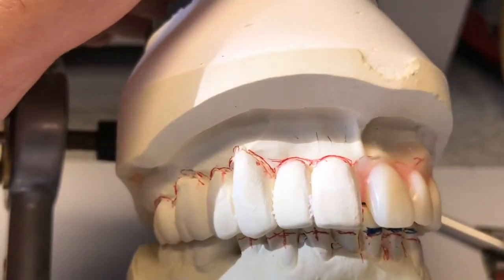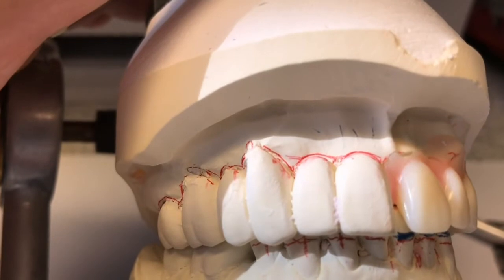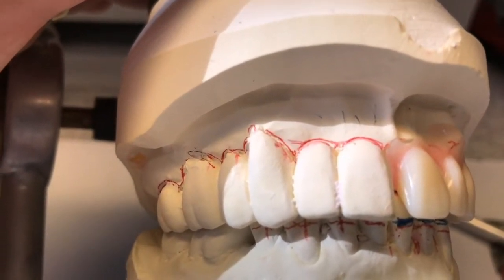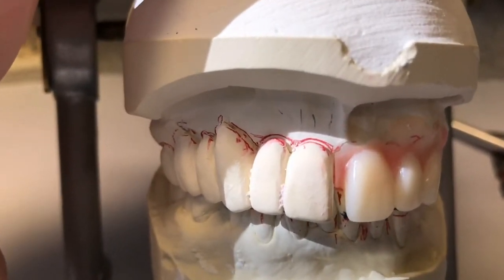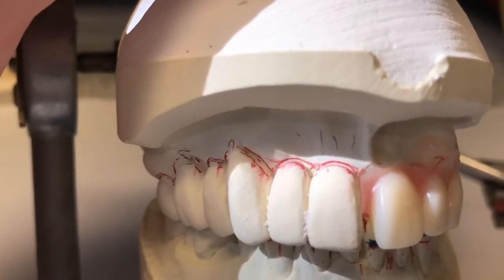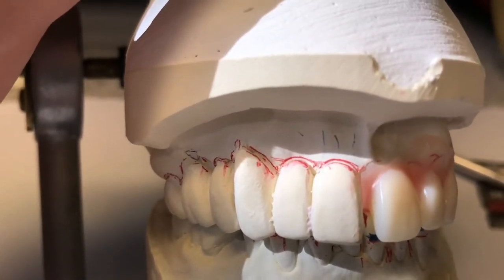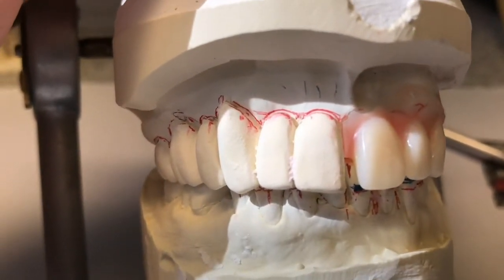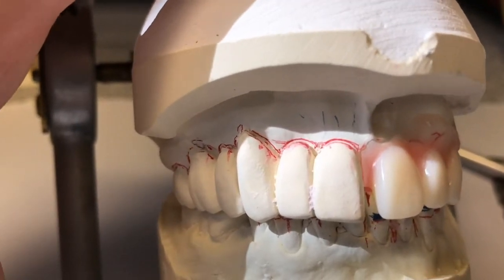When I surgerize the cast, I'm going to take away the teeth and not the soft tissue area. When you draw a red line around these teeth, it makes two marks — one on the tooth and one on the tissue. I'm going to take away the teeth and leave the soft tissue. Now if the patient had big undercuts in the ridge and we need the surgeon to do an alveoloplasty and remove bone, then I'd remove it off the cast and make a surgical guide. But in this case, we don't have big undercuts, so I'm only going to take off the teeth.